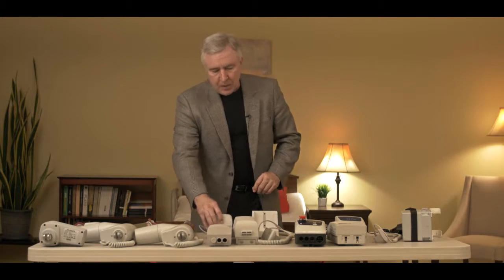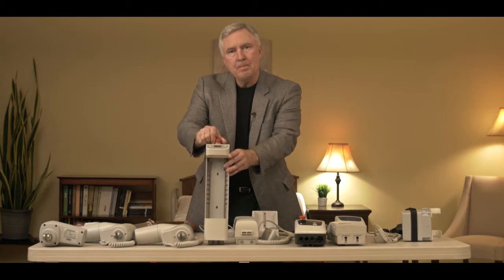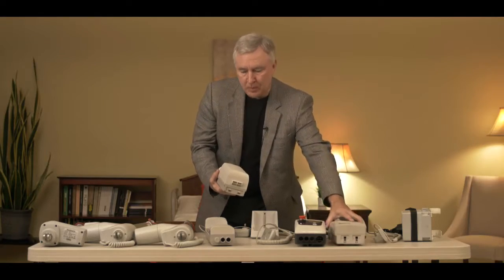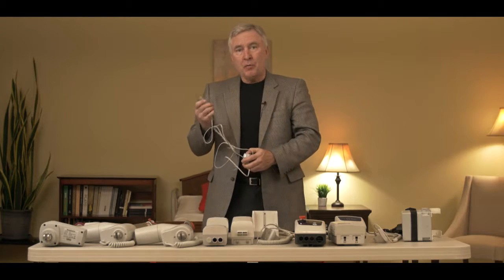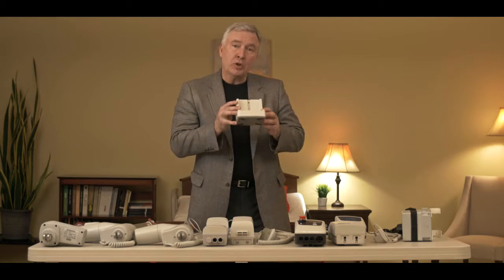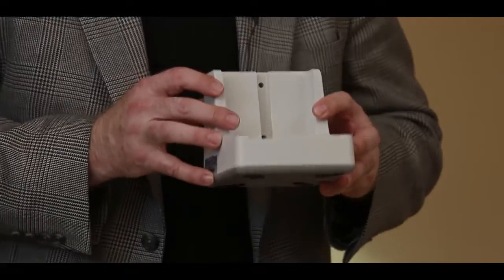Now the third style looks similar to Style 2, except the emergency stop button is on the top. The battery removes, but looks quite a bit different than Style 2. You also have the option of plugging the lift into the wall to charge it, or a wall-mounted charger or a desktop charger is available to charge a second battery on the third style of electronics.